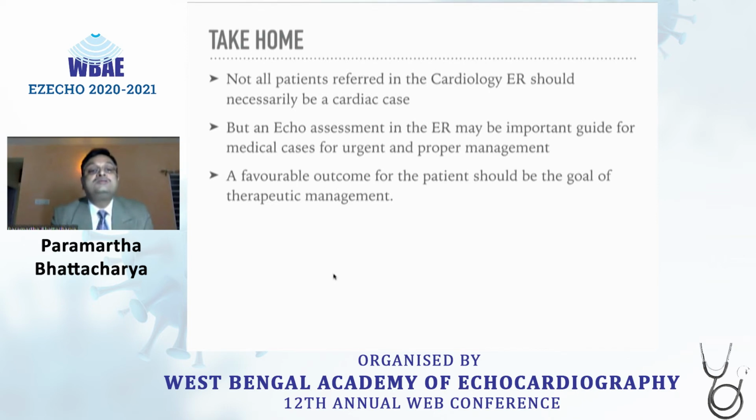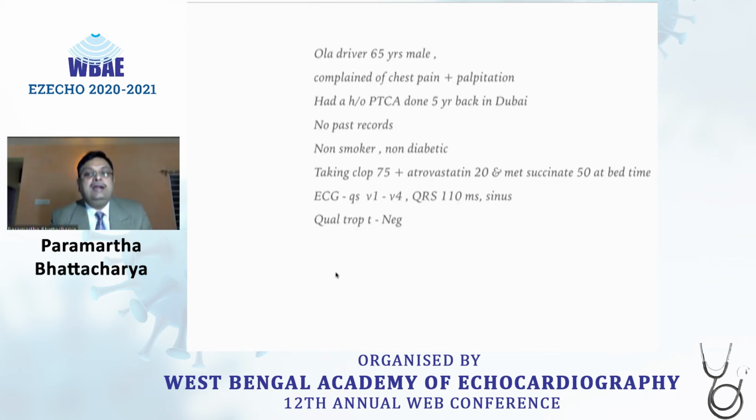So our take-home message is, not all patients referred to the cardiology ER should necessarily be cardiac patients, but echo assessment in the ER may be an important guide for urgent and proper management of medical cases. A favorable outcome for the patient is all we are looking for and should be the goal of therapeutic management. I'll end with the last case.